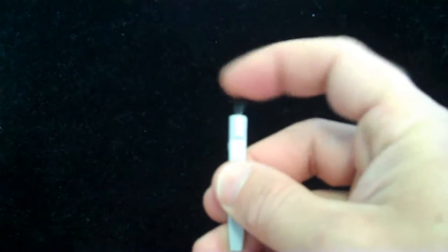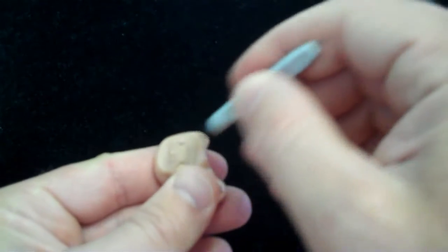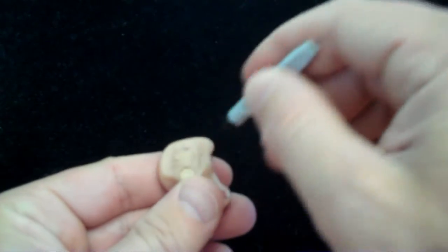On the outside of the hearing aid, take the black brush side here, and we're going to use that to brush off the faceplate and gently brush the sound intake or the microphone openings on the outside of the hearing aid. Alright, and that should cover how to properly clean both an in-the-ear custom device and a standard behind-the-ear as well.